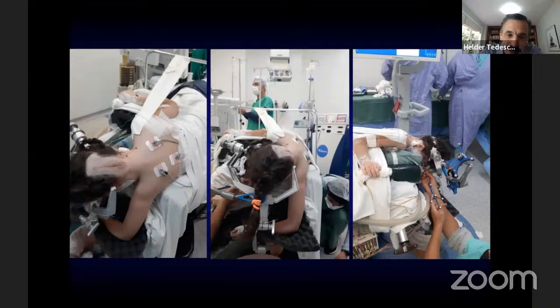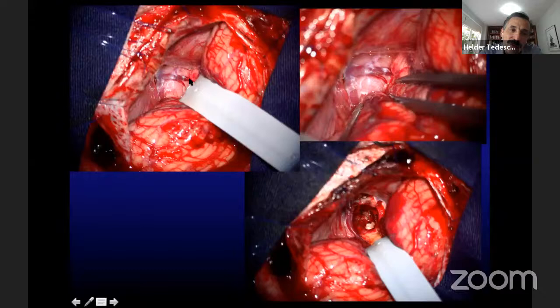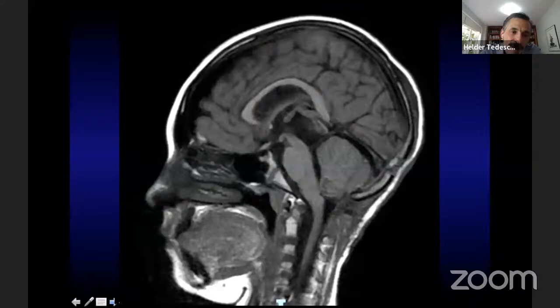And this was the previous surgery. We go a little bit more up so that I can have the sinus exposed. And then that's the position I have. This is the precentral cerebellar vein. I go down here, try to operate where the tumor is protruding inferiorly. We knew that it could be seen by transparency. And then I could operate this way and remove the whole thing.